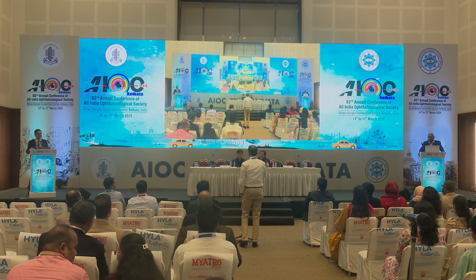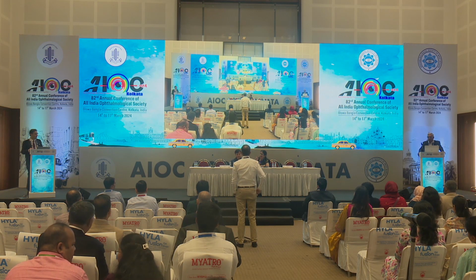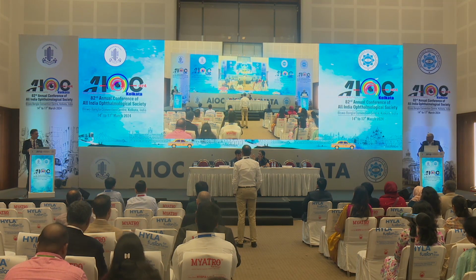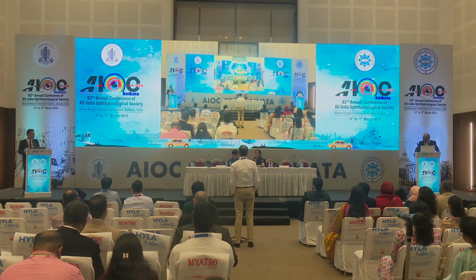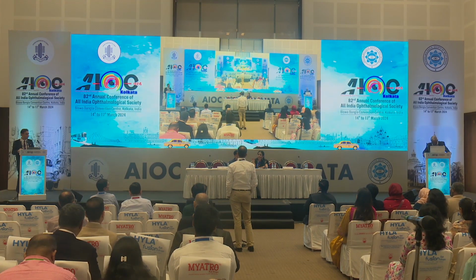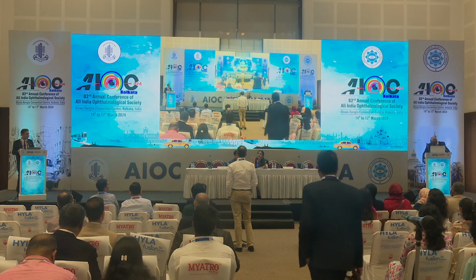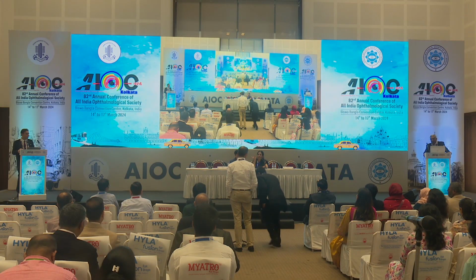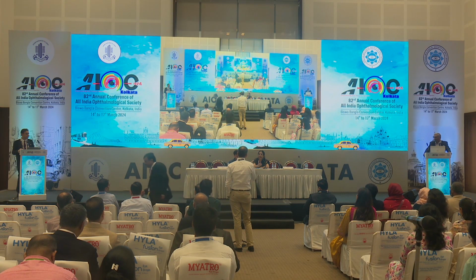No, what my thought was, it wasn't such a small residual. The patient had some minus 1.5 or something. It's still early on, hardly a year and a half since the primary procedure. So in those situations, I would lift the flap and treat, then play around with the epithelium is what I would do, and I wonder whether you concur with that.